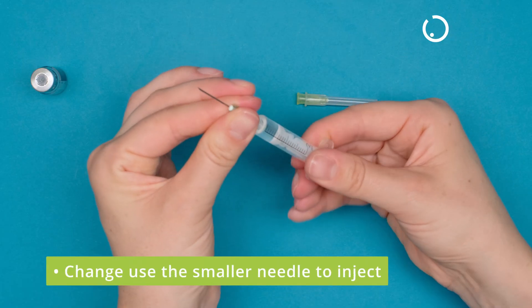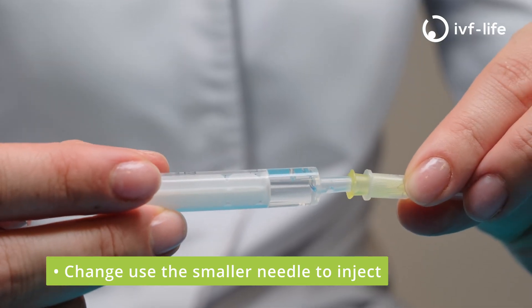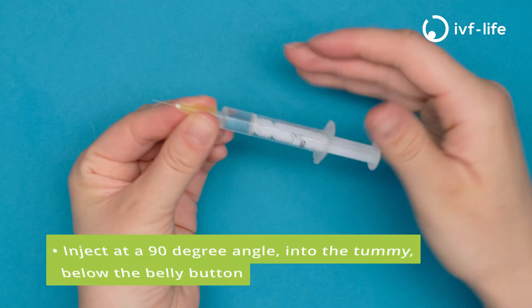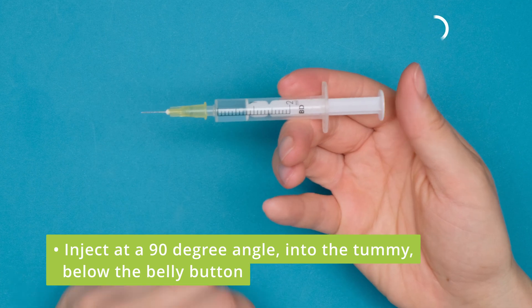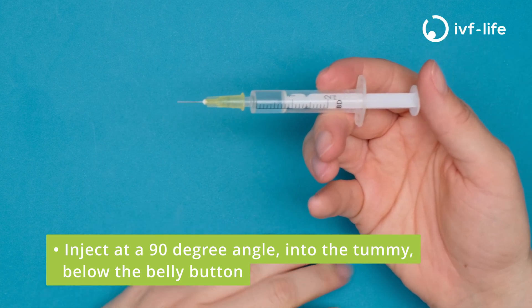Now we remove the larger needle and change it for the smaller needle to inject. Remove the protective cap. You're now ready to inject the medication by pushing the plunger into the tummy just below the belly button at 90 degrees.